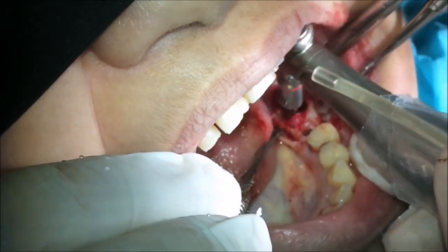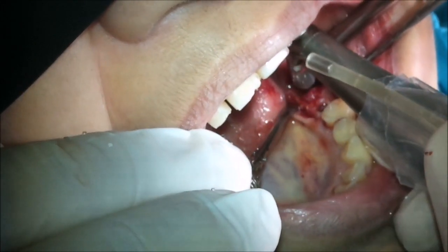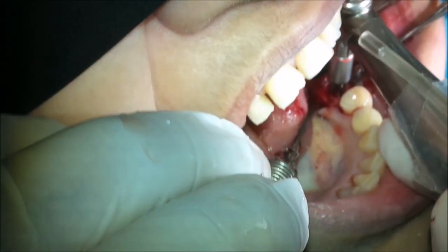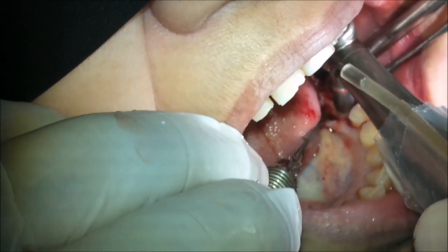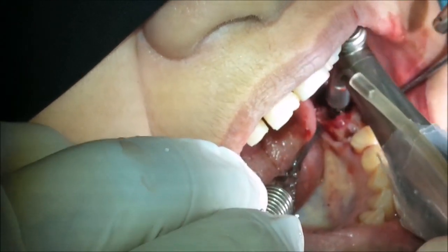Following the implant surgical protocol, we make the osteotomy using the initial drill, then gradually increase the size of the osteotomy site corresponding to the diameter of the implant that we are going to use.